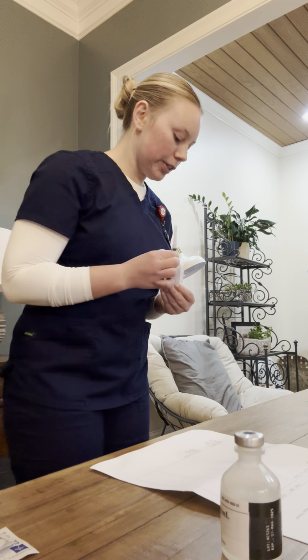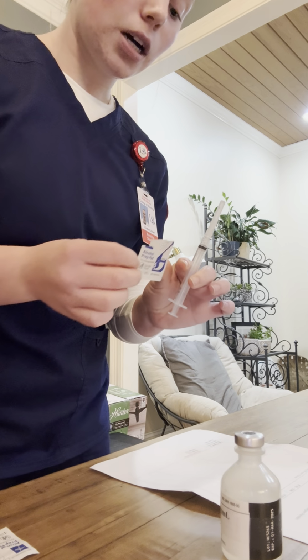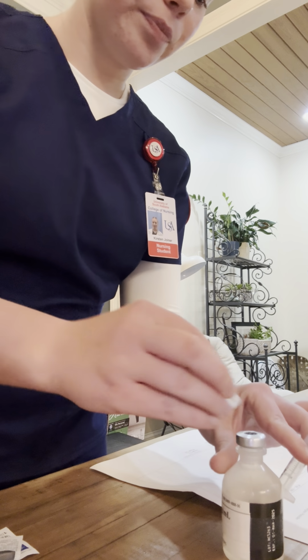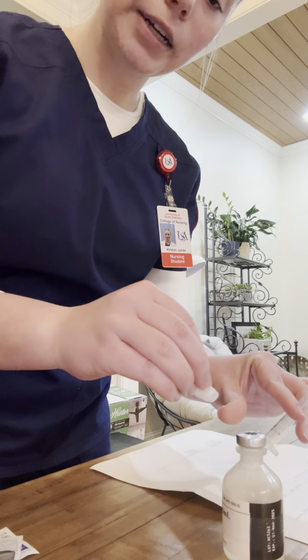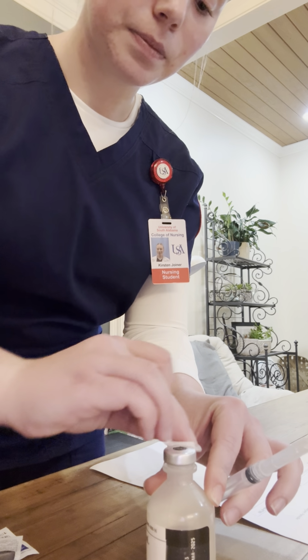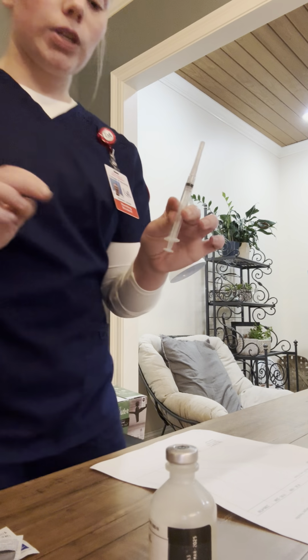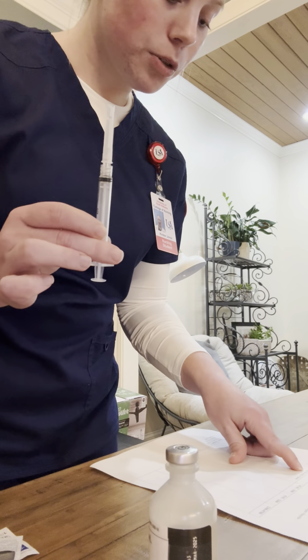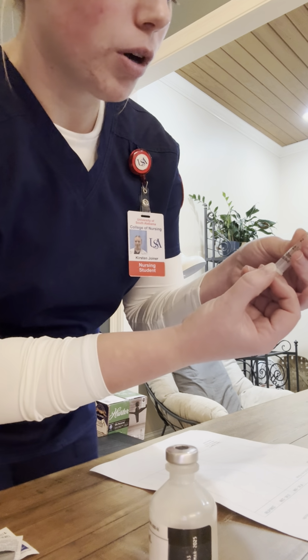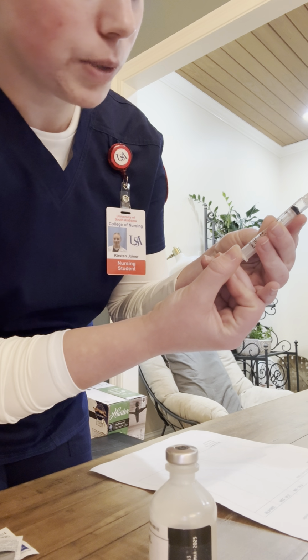My trash can is over here. And I would clean the top of the vial of our medication. I would start from the innermost area to the outermost. And I'll throw this away. So now I know that my correct dose is 5 milligrams, which is 0.5 milliliters. So I'm going to draw up 0.5 milliliters of air into my 3 milliliter syringe.